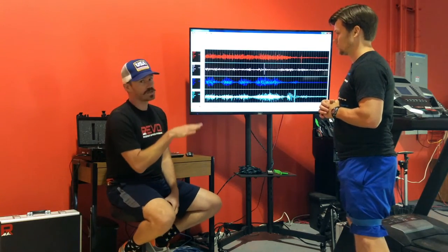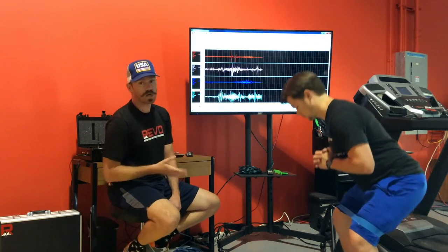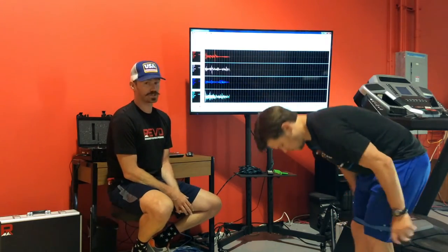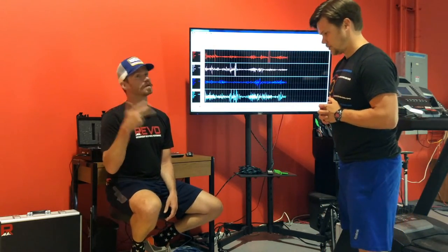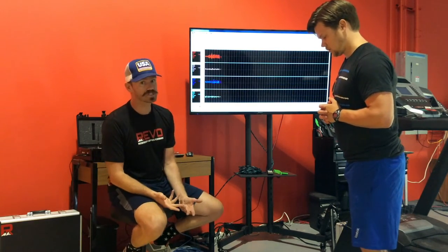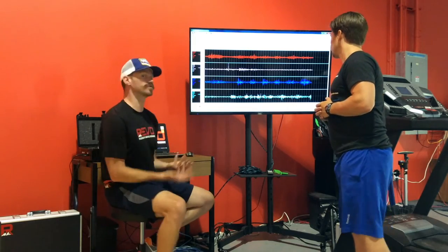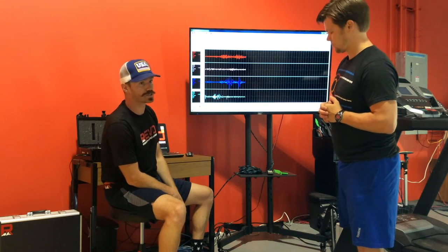Brian's going to do a couple of squats. This works as a diagnostic tool — are you patterning the way that we prefer? And also as a training tool: when Brian's doing kettlebell swings, squats, Olympic lifts, we can assess when the load increases, does the pattern remain the same? Brian's going through our activation series — we like to do standing fire hydrants, a little bit of skate to prime the glute max for most lower extremity activities, and then we look at these various patterns.